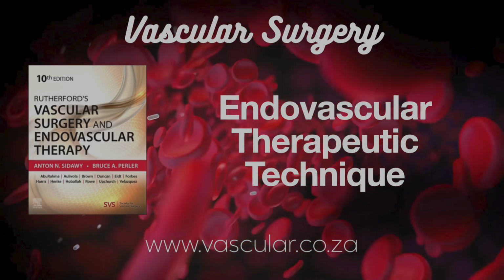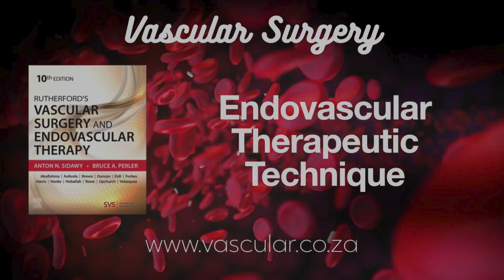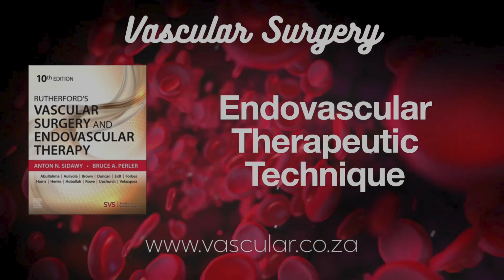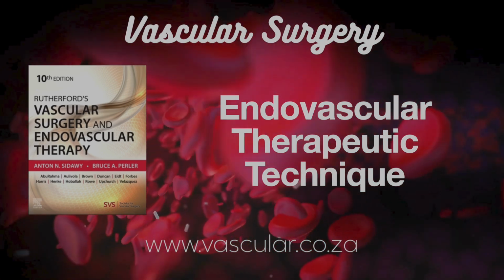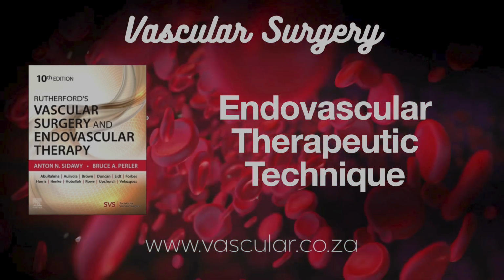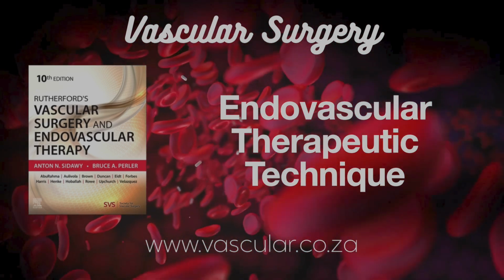Let's switch to removing blood clots now, thromboembolectomy. Right. Removing thrombus, blood clots, from arteries or veins. We have the classic Fogarty catheter for open surgery, but now many percutaneous techniques too. Coronary, peripheral arteries, DVT, even pulmonary and cerebral vessels. You can use clot-busting drugs, thrombolysis, but that has risks.